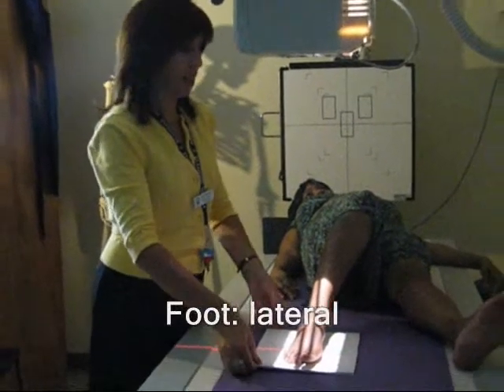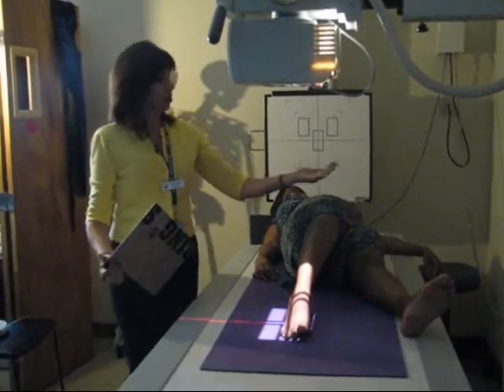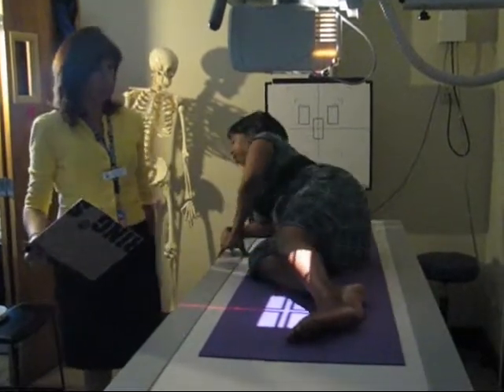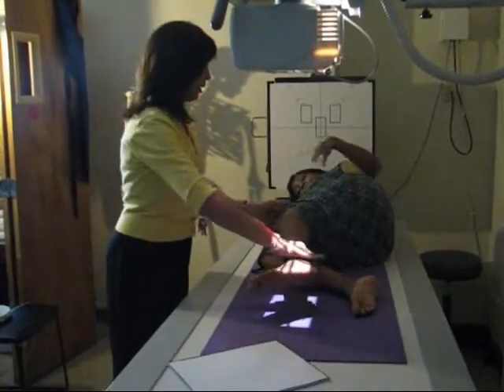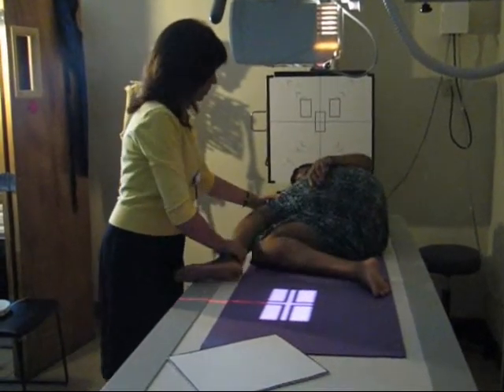For the position of the foot, we're going to ask our patient to lay on their side towards the affected side. We're going to have the patient bring the opposite knee up like this.